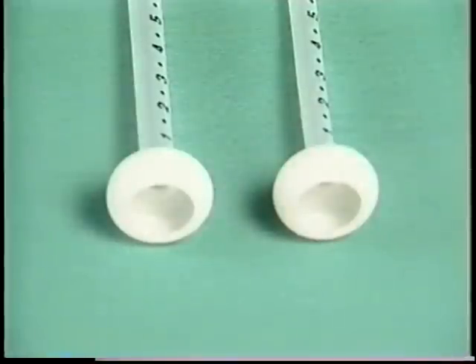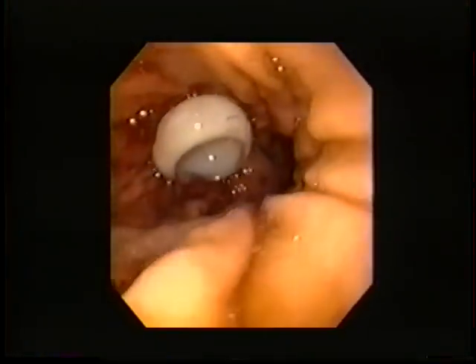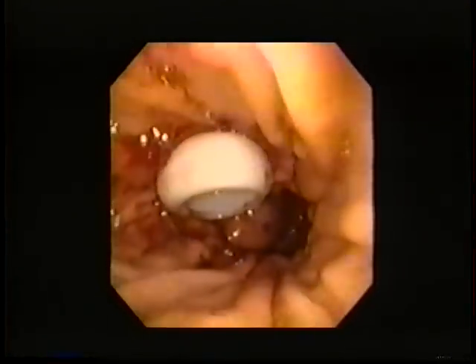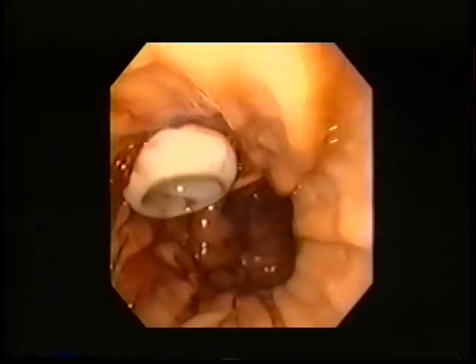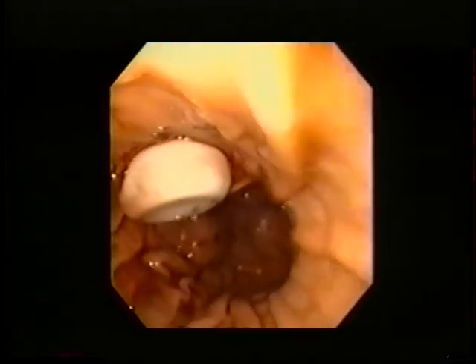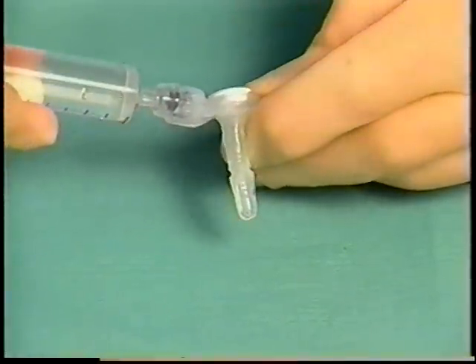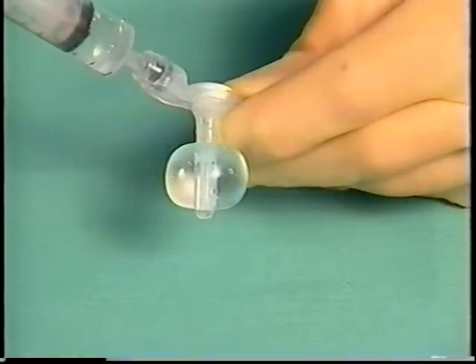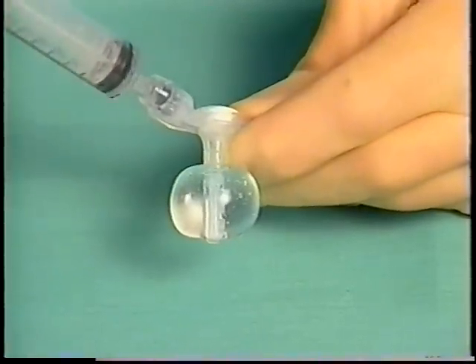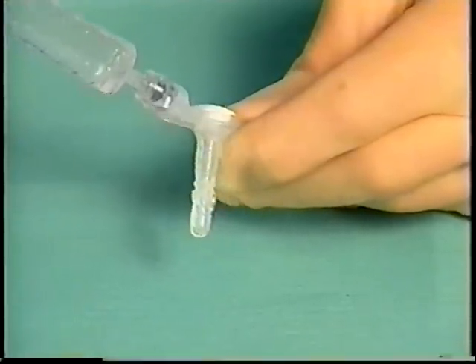The solid internal bolster is used for initial placement PEGs since it is generally very secure, requiring vigorous pulling for removal. This allows for formation of a well-healed stoma. This type of bolster also provides an advantage with combative or demented patients who may become confused and attempt to pull the PEG out. The balloon-type internal bolster is the option most often seen with replacement PEGs. The balloon-type bolster is generally less durable than the solid bolster. However, due to its inflatable-deflatable design, it is intended to be more easily removed when necessary.